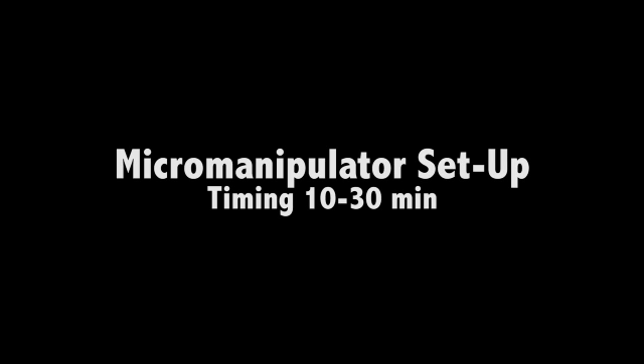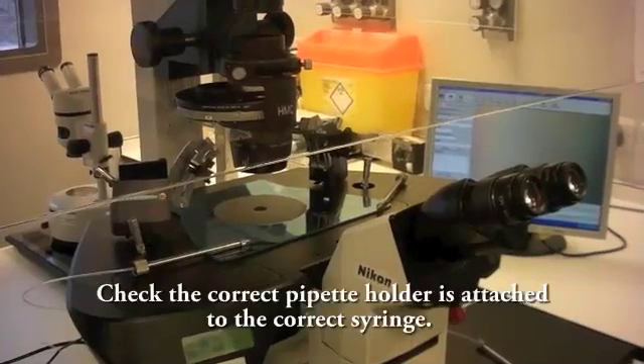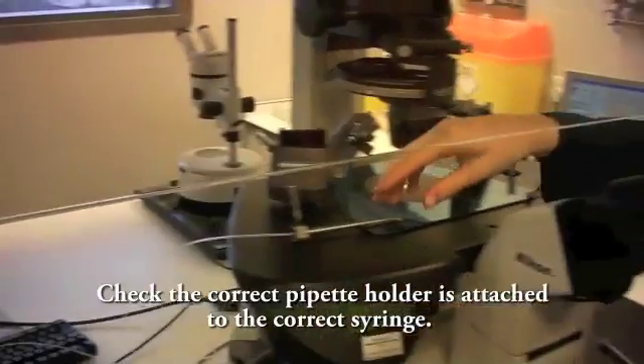Micro manipulator set up. Check the correct pipette holder is attached to the correct syringe.